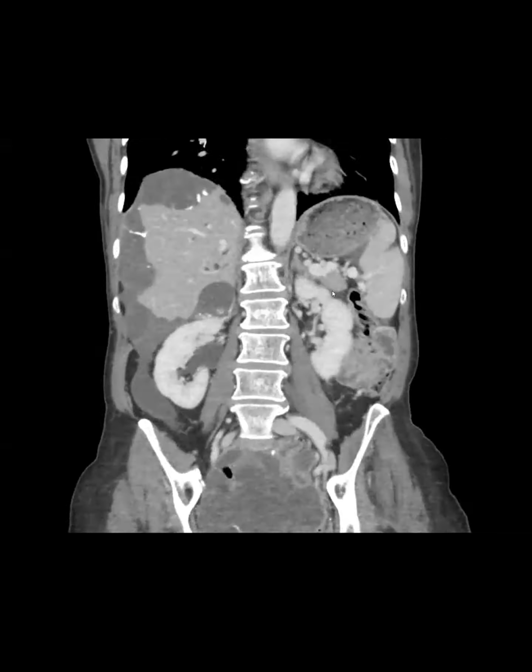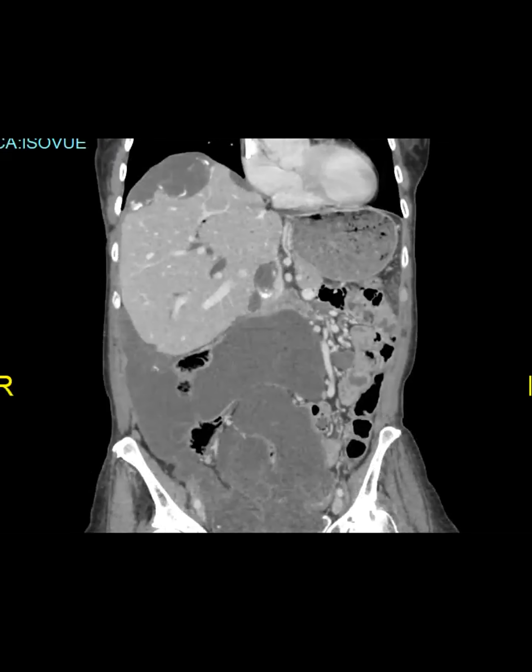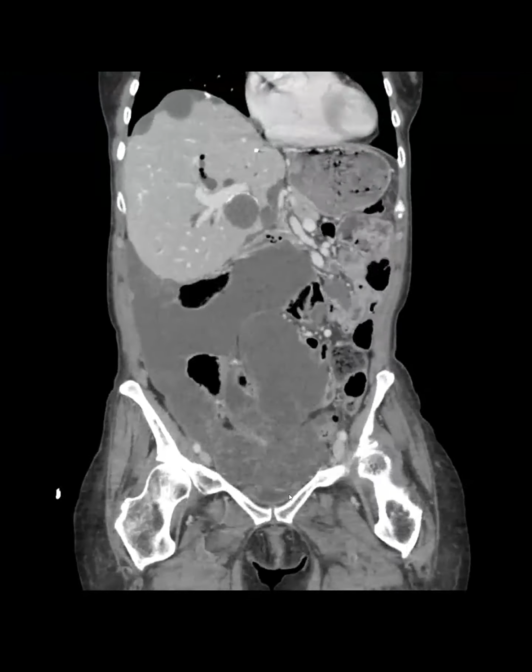I read the follow-up, so I don't know. I would say highly suspicious for IPNB, but Nelly, what else would you want to put in there? Just intraductal cholangio, or what else are you thinking from the original MR where you had all those super dilated ducts?